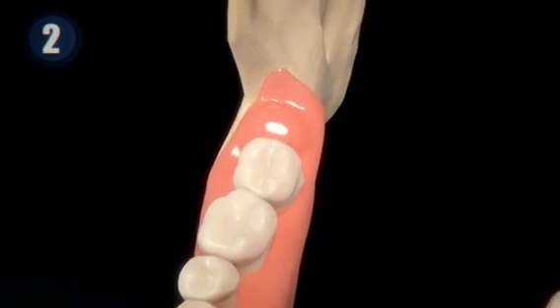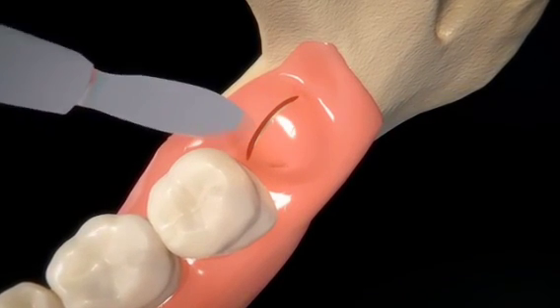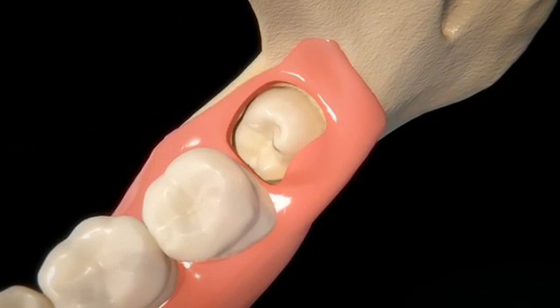And once it has been verified that the area is completely numb, a small incision will be made in the gum tissue to expose the bone that covers it and visualize the wisdom tooth.